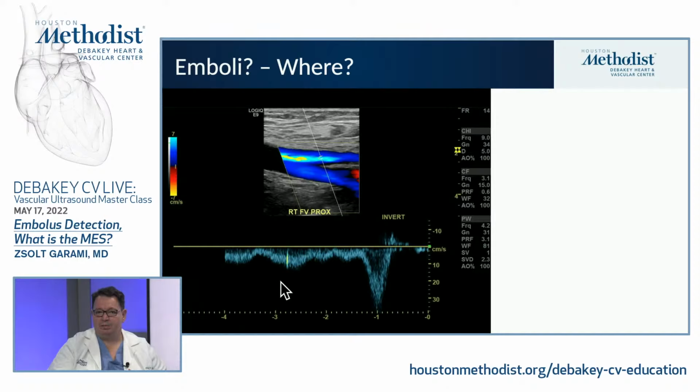Again, we are not paying attention because we're not recording. If you would hear bloop, bloop, bloop, you will pick it up. So we just need to pay more attention and also decrease maybe the gain a little bit more to be able to see this microembolus signal.